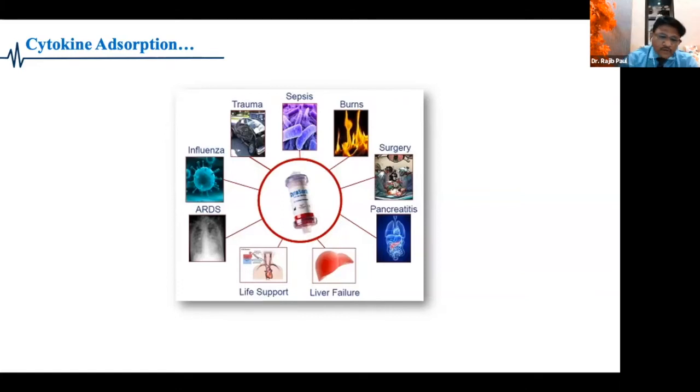And in today's day, talking of influenza, SARS-CoV-2, and ARDS. So this is a myriad of conditions where cytokinemias or cytokine storms happen, and Cytosorb can be life-saving in many of these situations if started on time.